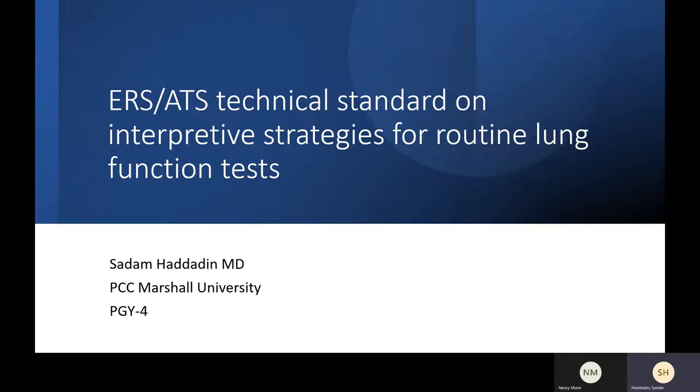Yes. So basically if you put those populations on the Z-score, they will be divided on the same scale. Not severity-wise, but they want standardized reading with upper and lower limits. And as I said, what we are interested in is the extremes. You don't want to miss the extremes.